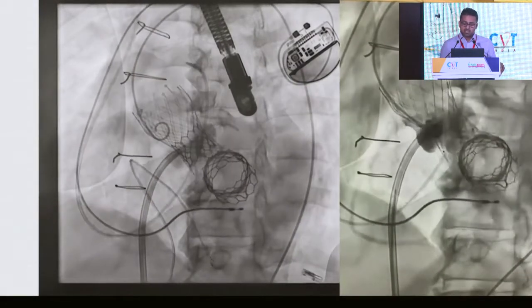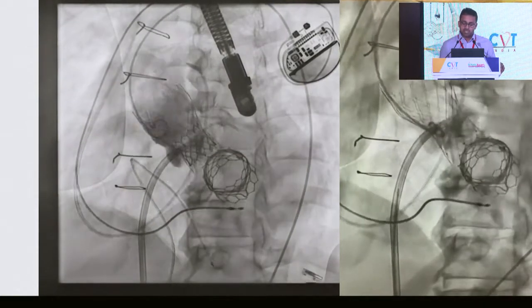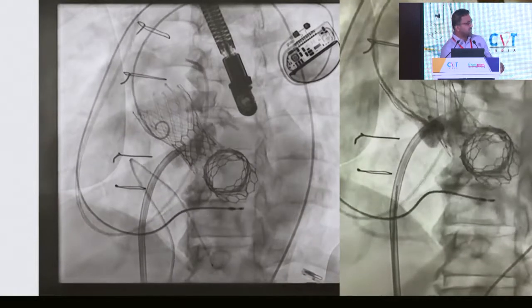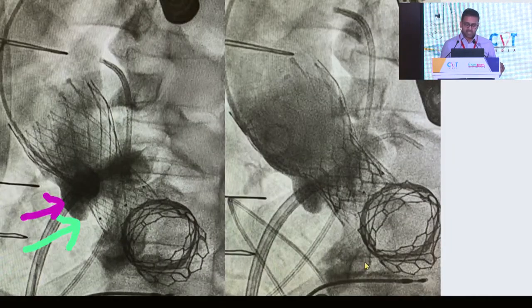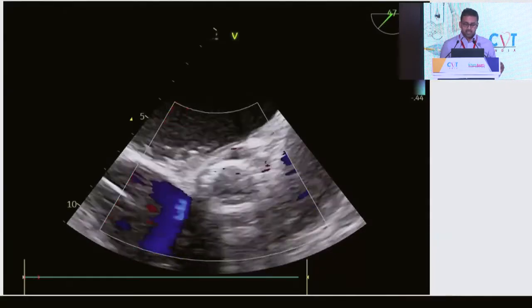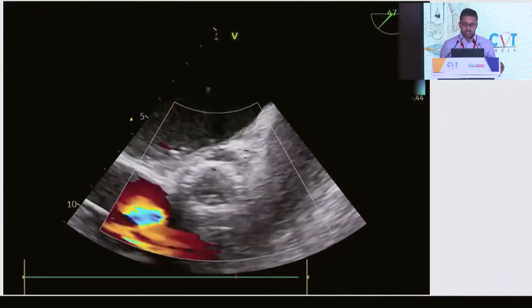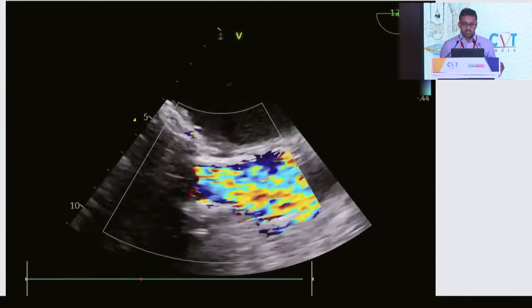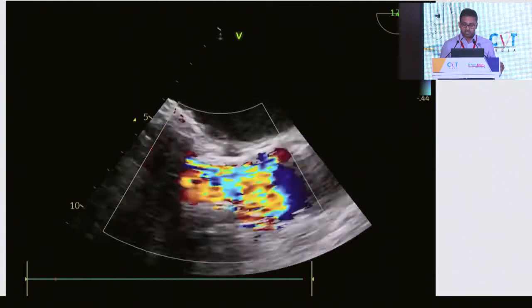And this is just a recap of what it was before. You can see here the landing zones defined there, and here this is the landing zone we got. And this is just another recap of the still images, and we clearly managed to sandwich the TAVR valve leaflets inside the Sapien. This is the post-echo. Clearly, the AR is gone as expected. And on the long axis, also, the patient had a very good outcome and was discharged.